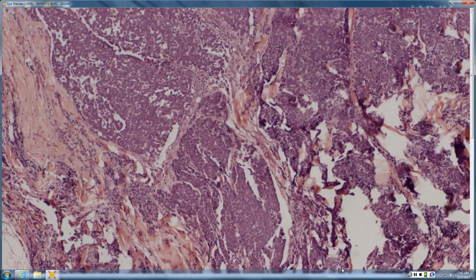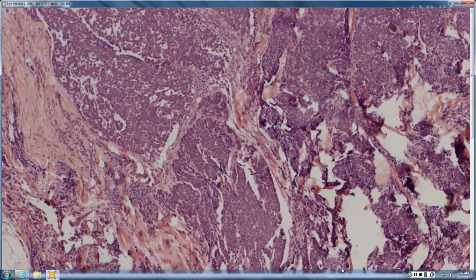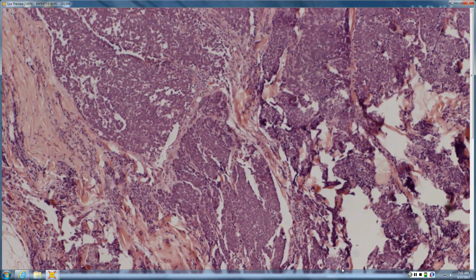So small blue cells, smudged, little cytoplasm. It's pretty much just nucleus. High nuclear cytoplasmic ratio, inconspicuous nucleoli, smudged chromatin pattern, trabecular growth pattern. Merkel cell carcinoma. Tend to be older people, head and neck, a little bit plum colored.